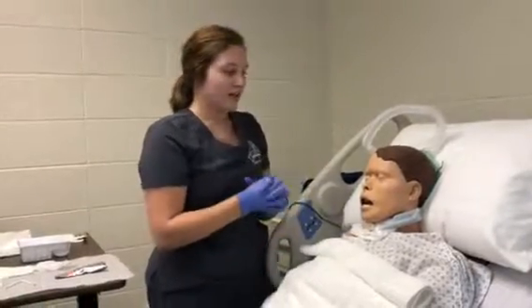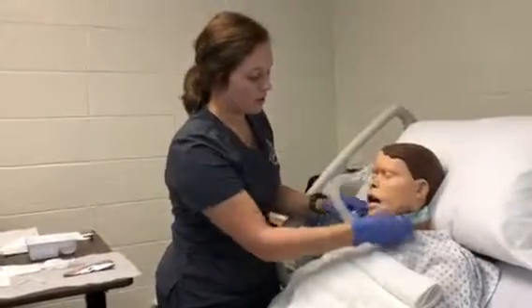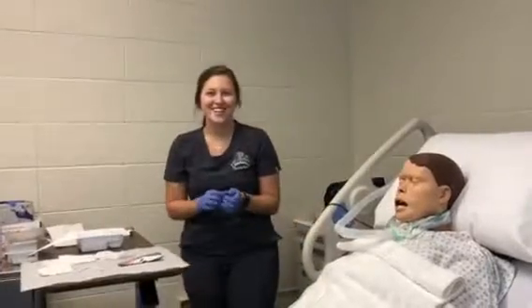And that is everything. You want to make sure you put your oxygen back on your patient and document everything you did. That's it. Thank you.